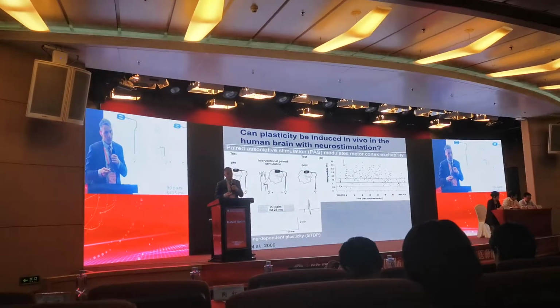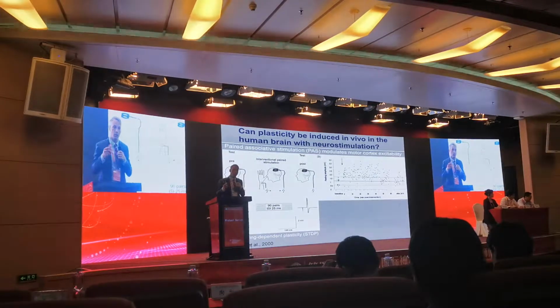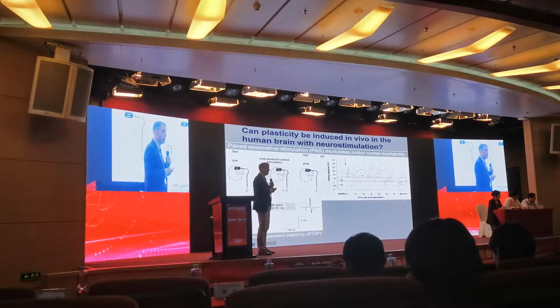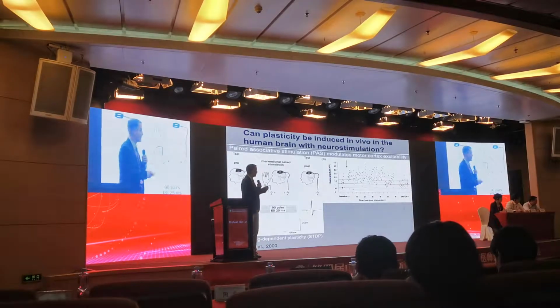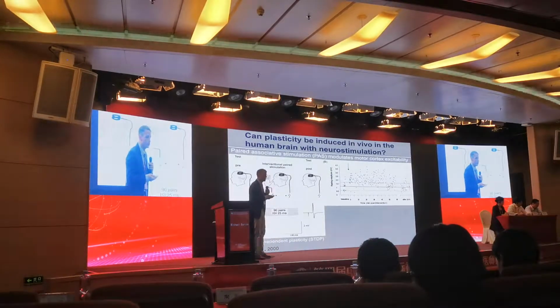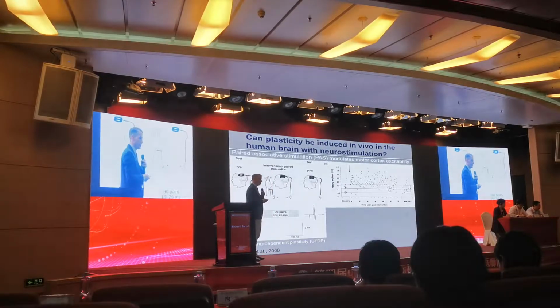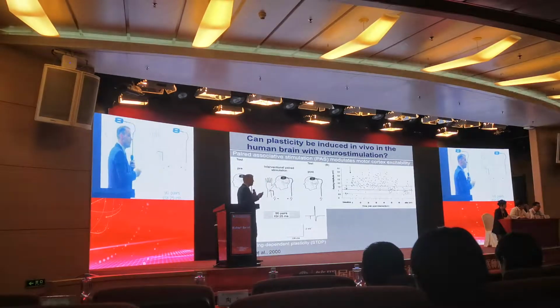Okay. And so what I'm going to focus on, since I think there's going to be a number of talks on repetitive TMS and other more classical forms of stimulation, I'm going to take one moment to talk about how we measure and modulate plasticity directly, or at least what we think are systems level indexes or relations with classical synaptic plasticity, and that's through a technique called paired associative stimulation, where we pair peripheral stimulation of a peripheral nerve, in this case the median nerve in the right arm, and then we combine that in time to try and have synchronous arrival of the afferent input from the peripheral stimulation with the cortical stimulation from TMS, both guided to that left motor cortex. If you get the timing right, i.e.